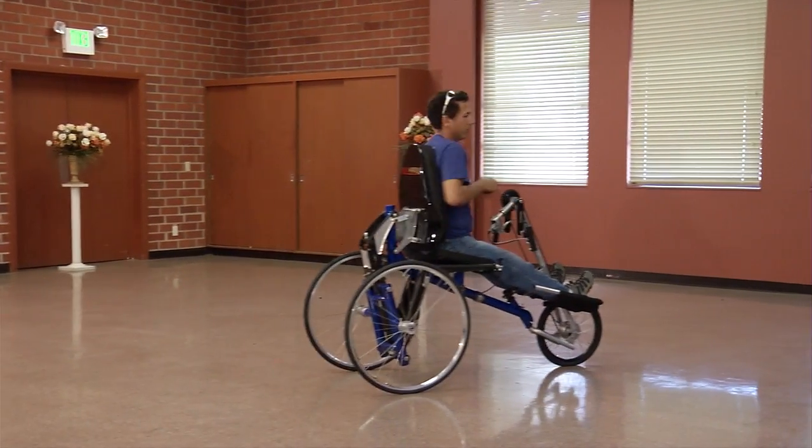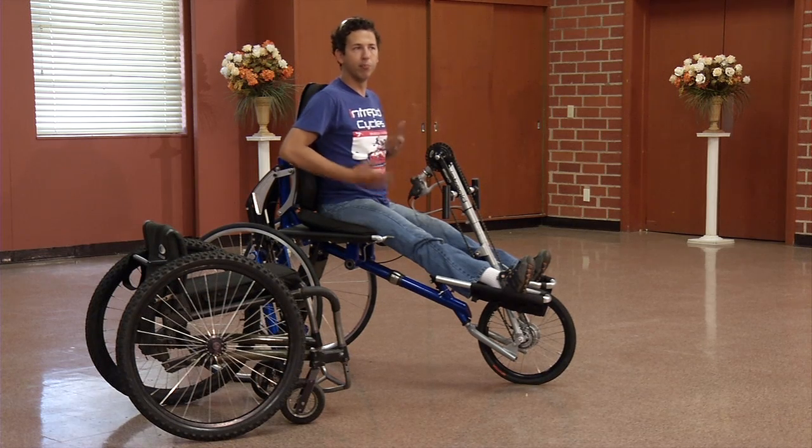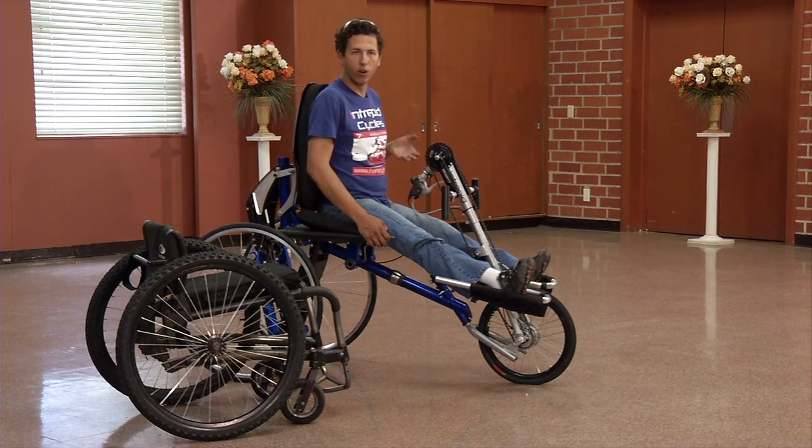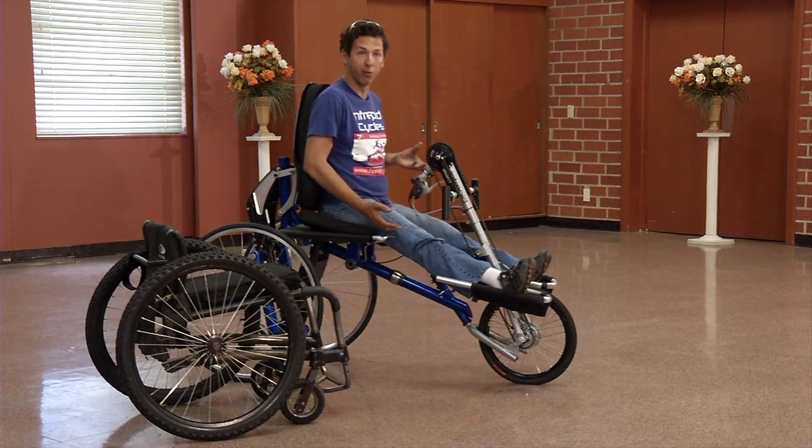One of the unique things about the Morphing Hand Cycle is this ability to adjust height. One of the things that is often very hard for a hand cyclist is transferring in and out, especially in a super low bike. There are many factors to consider when looking into what hand cycle you should be riding, and probably the most important of those, at least from my perspective, is practicality and comfort — because if you have a bike that's very difficult to use and uncomfortable, you're not going to ride it as much.